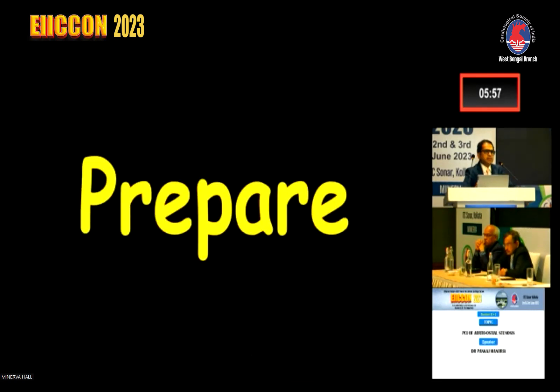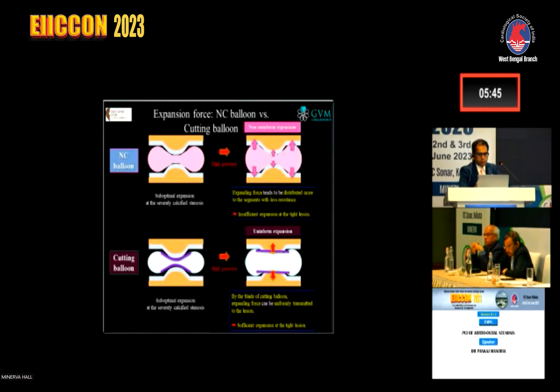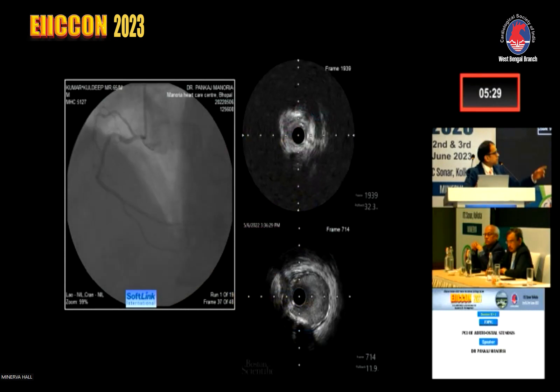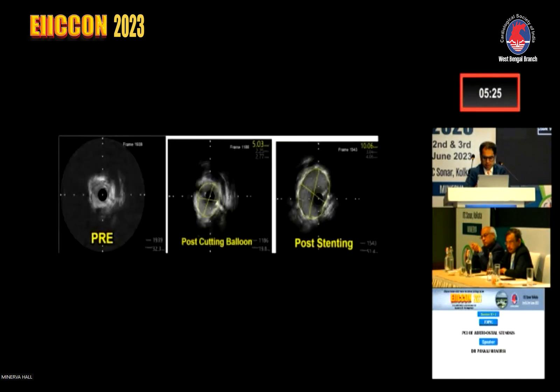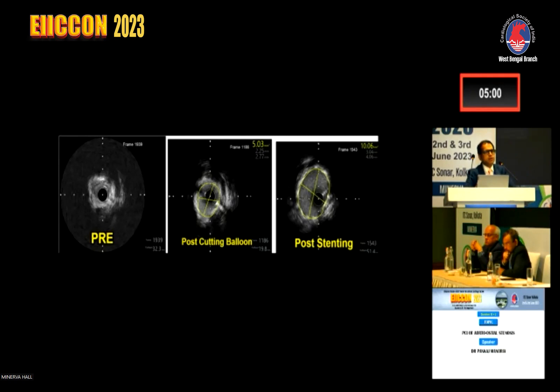The second step is preparation of the lesion. These lesions are very fibrotic and have a tendency to recoil, so preparing them before putting a stent is very important. The best way is by using a cutting balloon, which causes uniform expansion, versus an NC balloon which expands at the area of least resistance. This was an aorto-RCA ostial lesion — a very tight fibrotic lesion of the RCA ostium. We prepared it with a cutting balloon, did IVUS to confirm good result, and then only put the stent. The images before, after cutting balloon, and post-stenting are all very important. If you haven't done good work with the cutting balloon, expanding an undilated stent at the ostium may be very difficult.